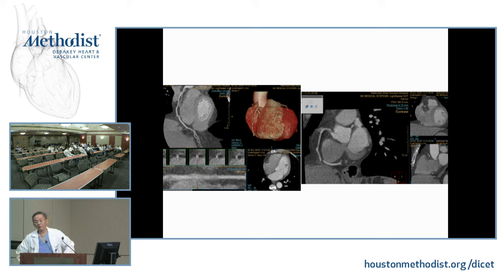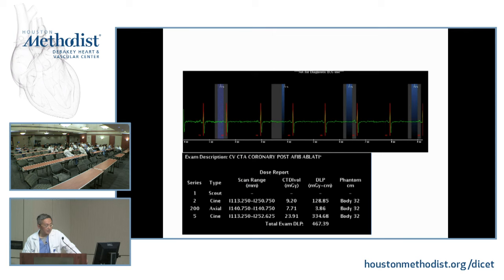The technician called me, both of them, the heart rate in their 50s. So there's quite a bit of step artifact you can see between the slices. Okay, so what do you expect the EKG to be? I would expect the EKG to be irregular in this case. Irregular, okay. So probably not bad. So this is the EKG. Okay, it was slow, but it's irregular.